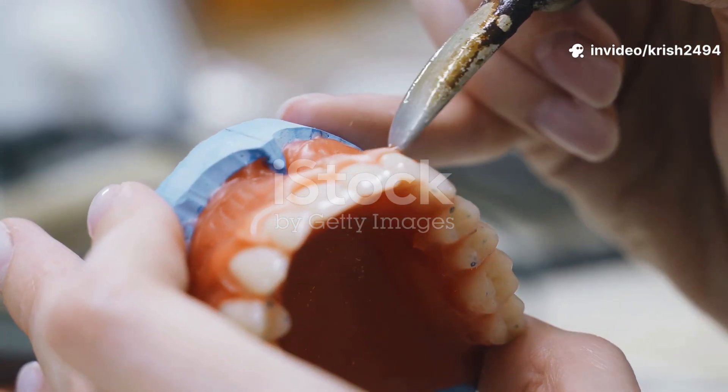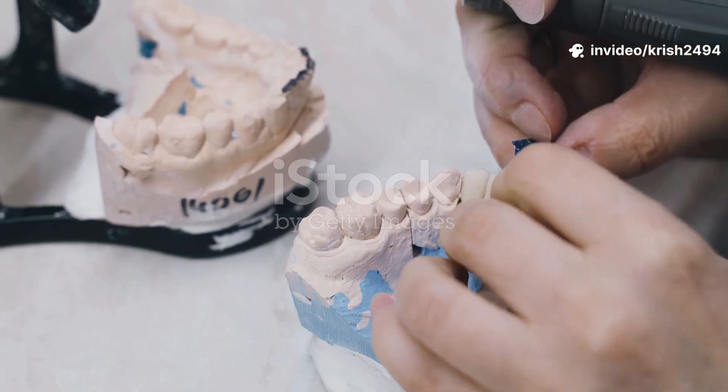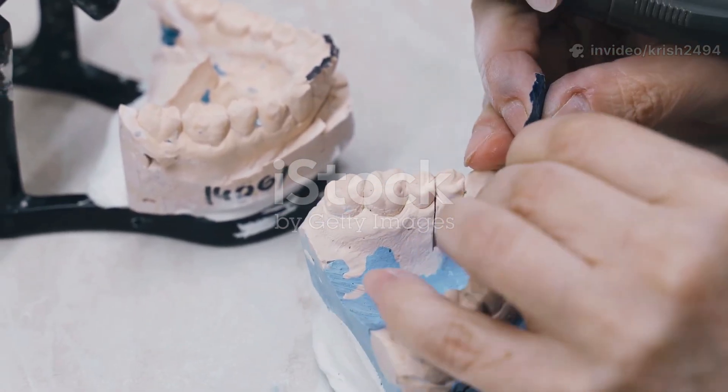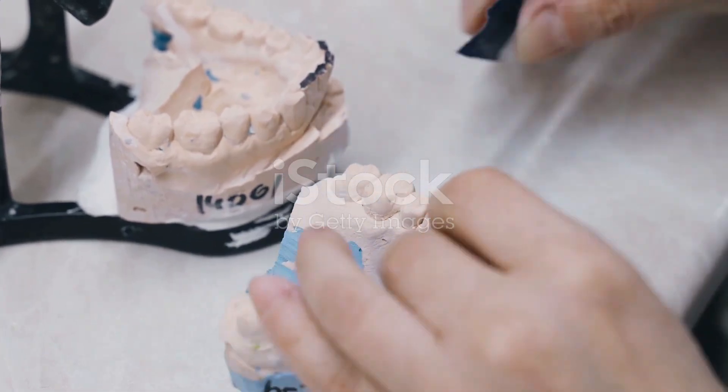Alright, let's break down exactly how a full set of dentures is made in a dental lab, step by step. If you've ever wondered what happens behind the scenes after your dentist says you'll need complete dentures, this is for you.